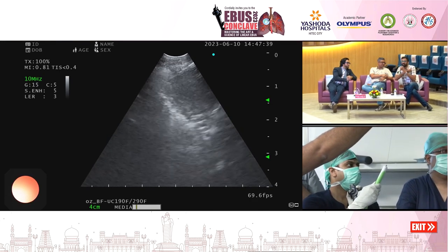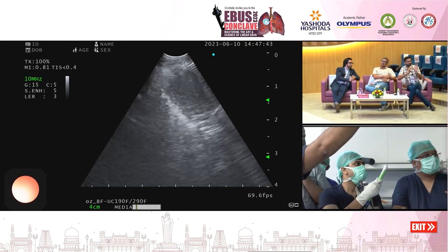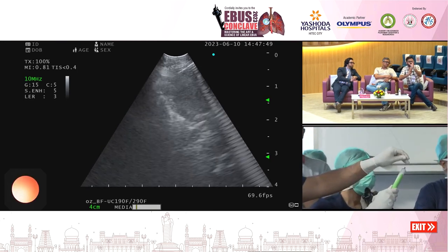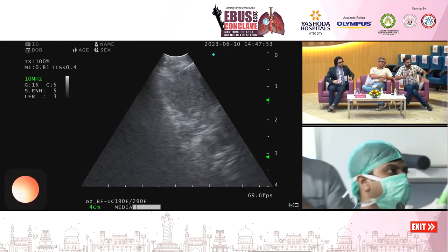There are two things regarding it. One is the safety of the procedure. In terms of safety, going to the center might be the safest because you have a margin of error. But in terms of diagnosis, they say that the periphery of the node is where the malignant cells are more easily picked up. So I think this is what I was waiting to hear.